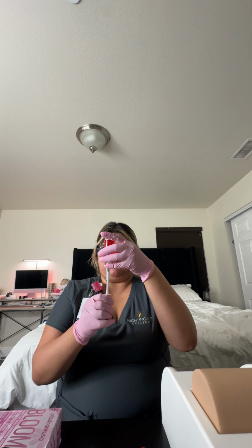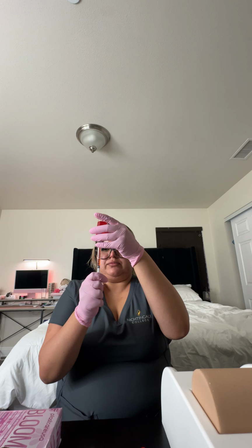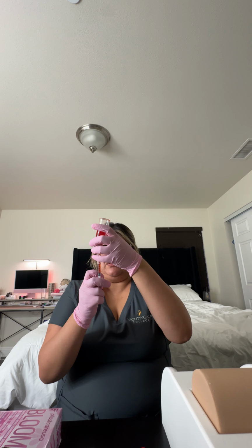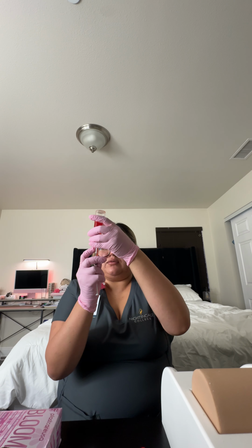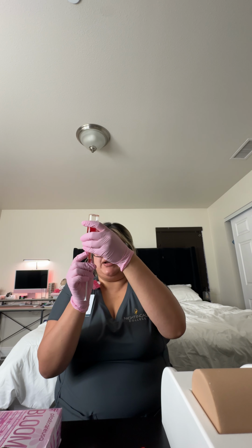Okay. We're going to remove our cap and we're going to inject this into the vial. We're going to inject the air and now we're going to invert and we're going to draw up the medication. We're going to make sure we don't have any air bubbles. Okay, so there are no air bubbles now. We're going to go ahead and withdraw that.